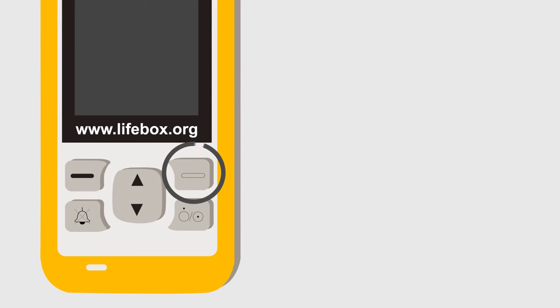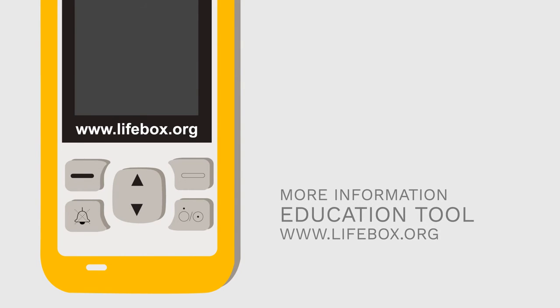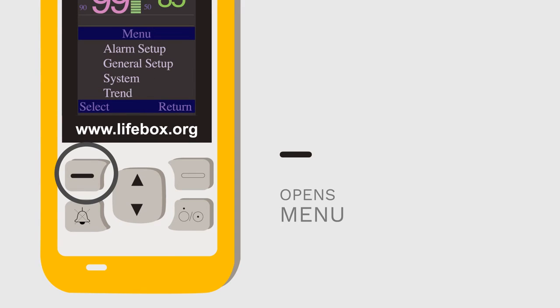Right above it is a button that allows you to turn the pulse rate waveform on or off. You can read the waveform to obtain additional information about your patient's circulation. To learn more, refer to the education tool or the Lifebox website, www.lifebox.org. On the opposite side, this button opens the menu.